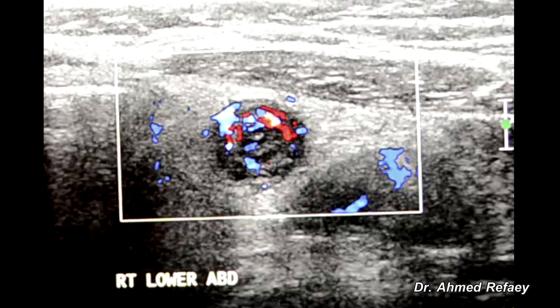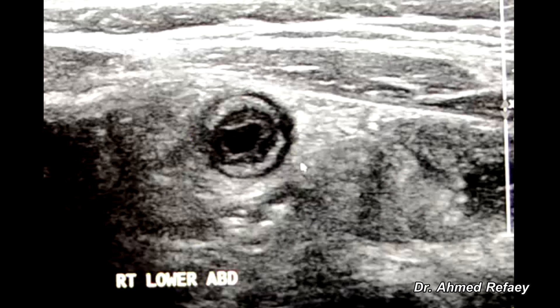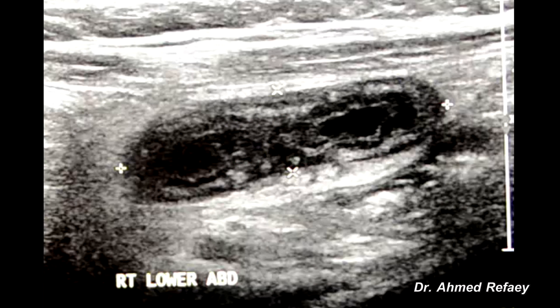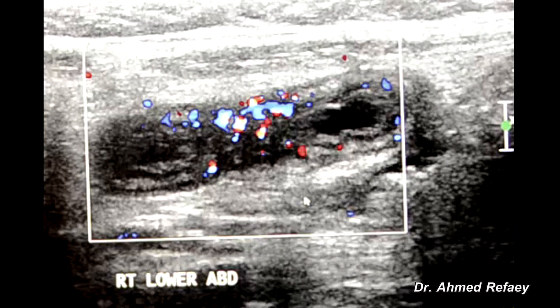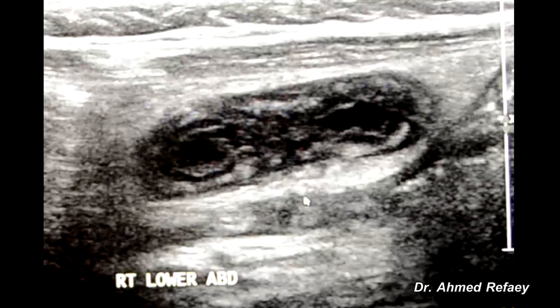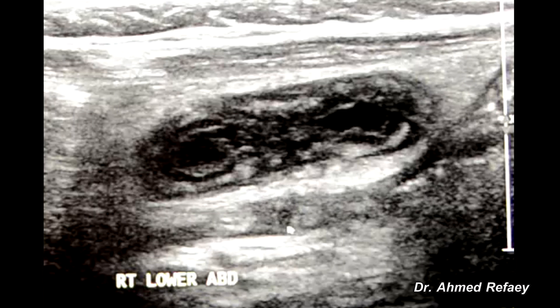Using color Doppler study, we can appreciate marked hypervascularity of the wall of the appendix. You also notice that the hypoechoic appendix is surrounded by hyperechoic fat — this is periappendiceal fat. On longitudinal scan, the appendix is markedly dilated, seen as a blind tubular structure with diameter more than 8 mm. There is no evidence of intraluminal appendicolith and no significant periappendiceal fluid collection in this case.